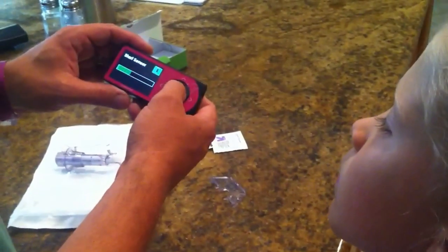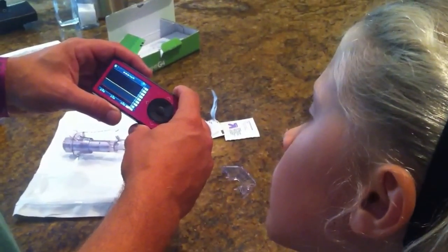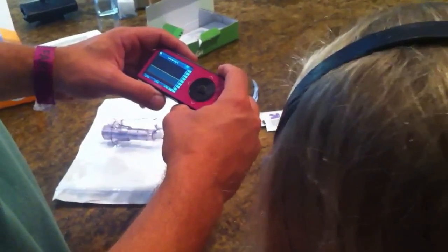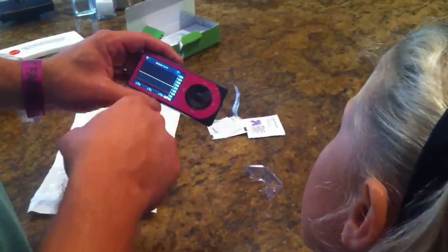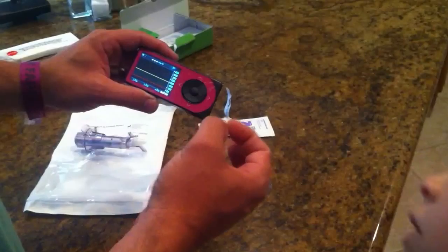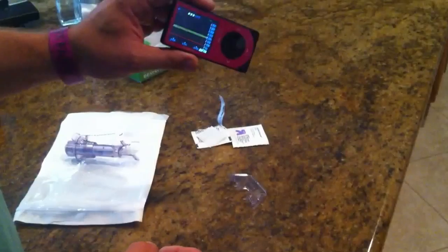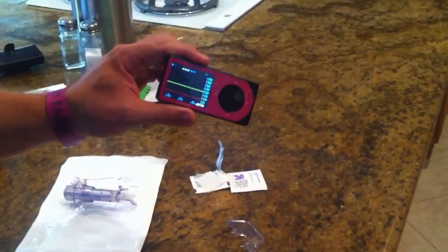Start sensor. Okay, it's finding your sensor. So now, Ella, see this little green thing? It takes about an hour for it to calibrate. And when that hour is up and it's green, it'll ask you to do a blood glucose, and then we'll calibrate it against the monitor. Within an hour we'll be up and running, and every five minutes we'll be able to see your glucose. So hopefully tonight we won't wake up multiple times.